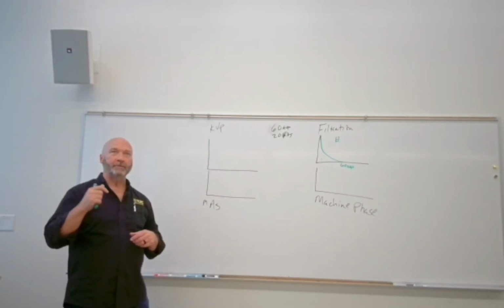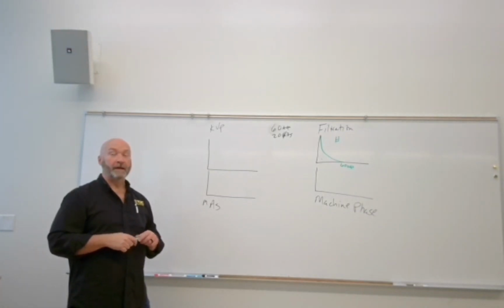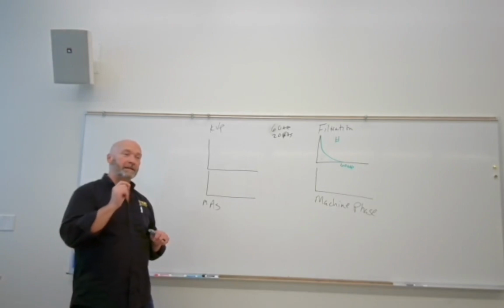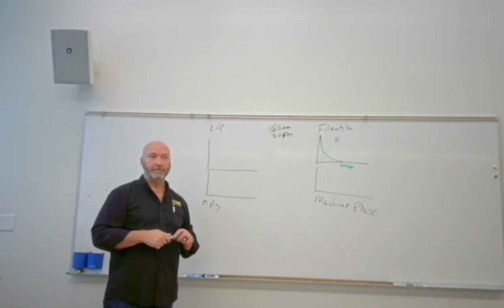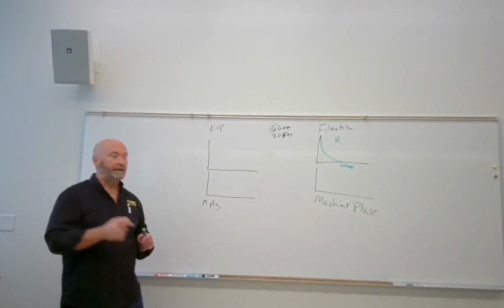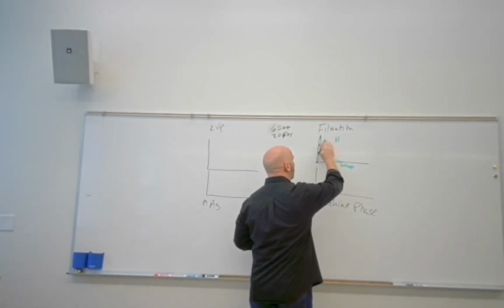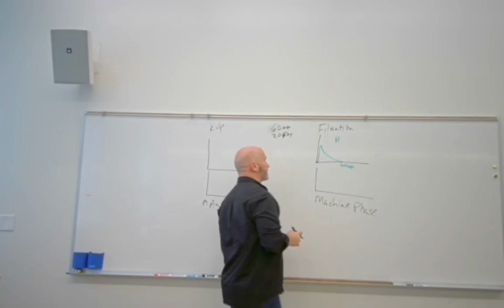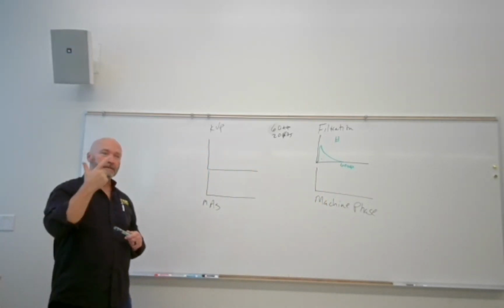Is glass radiopaque? Ever heard the word radiopaque? Not since the first semester when I told you that nothing is radiopaque. You talking about that? Okay, so it's radiolucent, meaning that it's going to absorb some of these, right? So now our Brems spectrum looks like that. I gave you a spoiler alert. What's the second thing it hits?